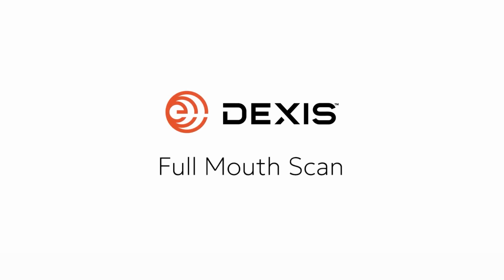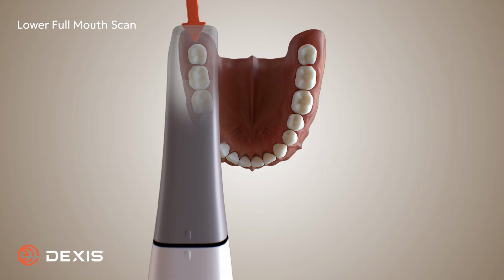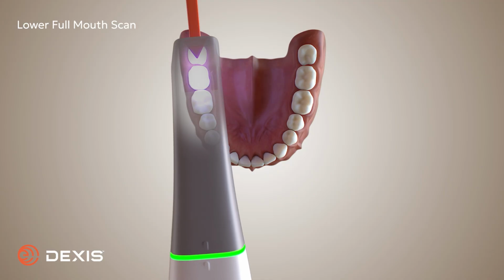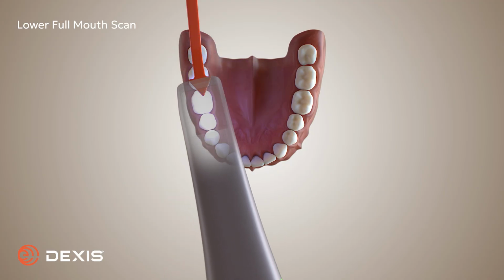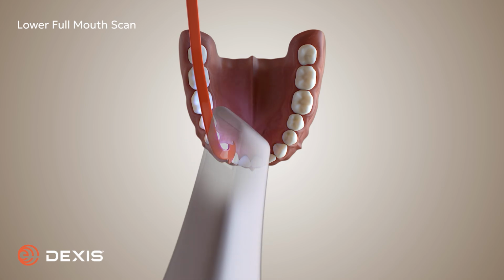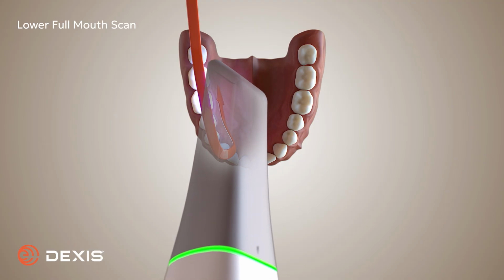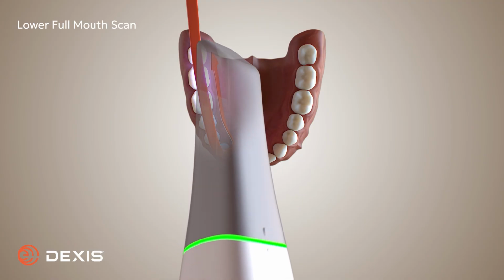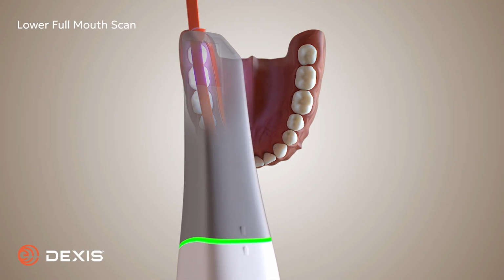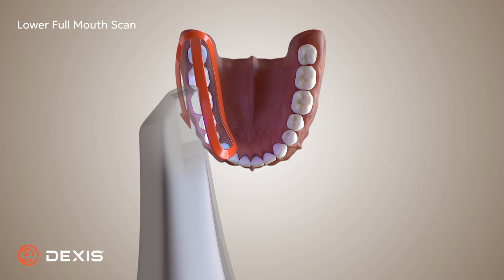Full mouth scan. Begin on the lower right arch. Place the scanner on the occlusal surface of the last molar and glide forward to the canine, keeping light occlusal contact. At the canine, rotate 45 degrees lingually and scan back toward the molar. Move over the occlusal surfaces to the buccal, maintaining a 45-degree buccal angle as you scan from molar to canine.